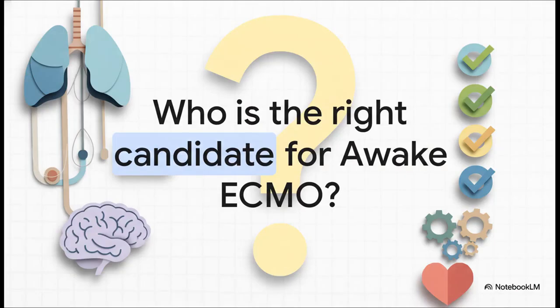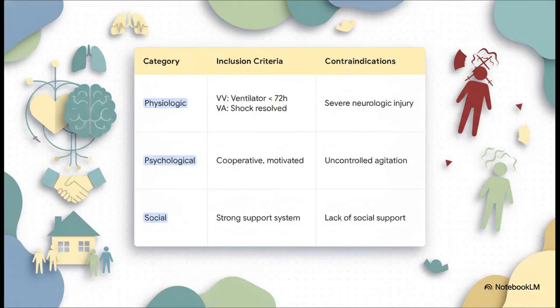But, and this is a huge but, this advanced strategy is definitely not for everyone. You can't just wake a patient up and hope for the best. Initiating Awake ECMO demands an incredibly meticulous, multidisciplinary assessment. Patient selection is absolutely paramount to ensure both safety and success. This table really lays out that rigorous selection process. Physiologically, the patient needs to be stabilizing. They need to be on the upswing.